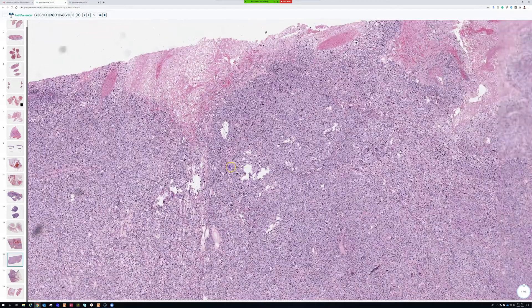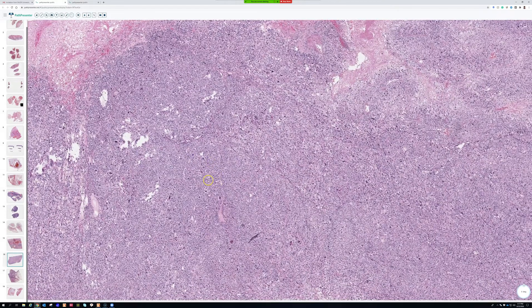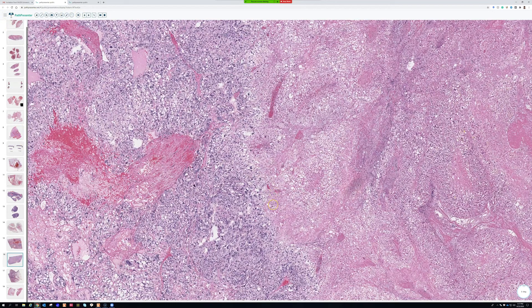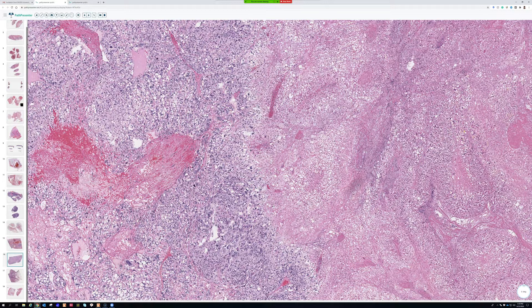Yes, you must have a lipoblast to make a diagnosis of pleomorphic liposarcoma. The general rule — as covered in the liposarcoma 101 video in depth — is that an ugly, high-grade sarcoma with lipoblasts is pleomorphic liposarcoma. DDLPS does not have lipoblasts. That was the easy rule from the WHO book.